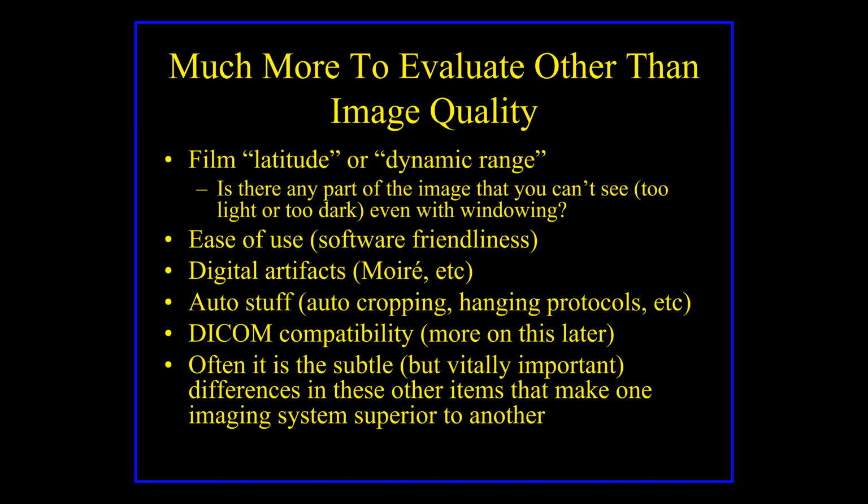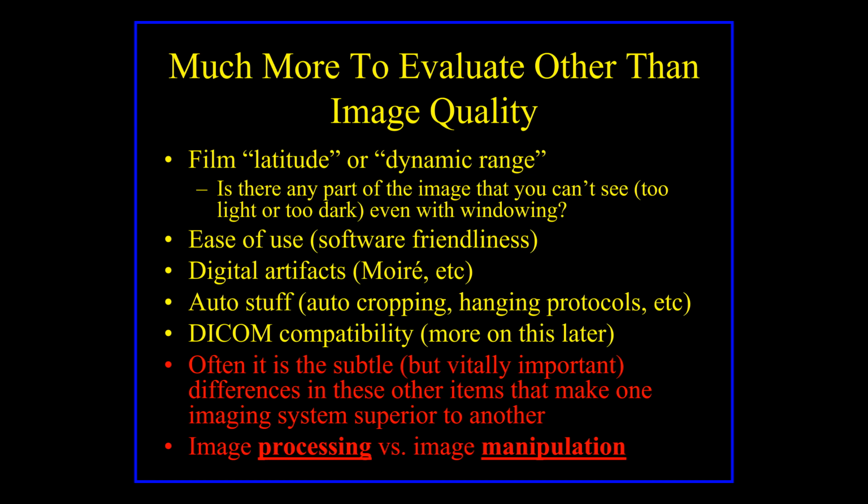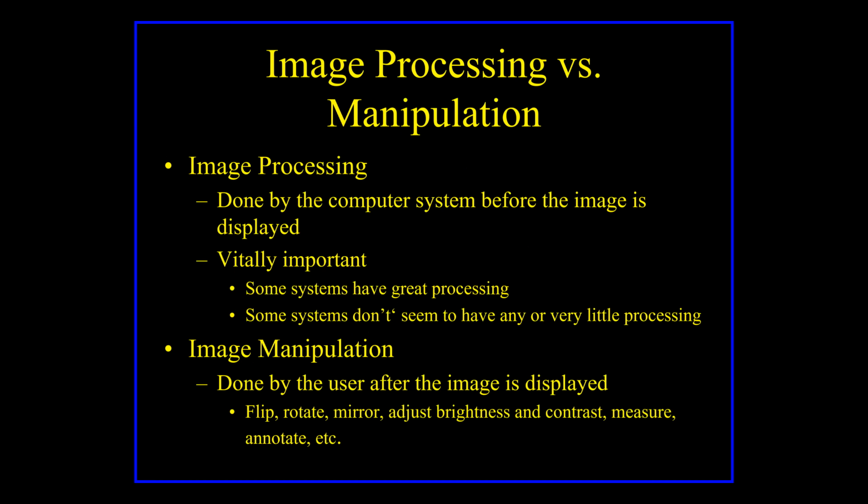So again, some of these differences are very subtle, like the auto stuff and is it fully DICOM compatible? But also some of them are really, really important. So you want to make sure that whatever system you have, everything works together and it will result in a good image that you can store and send around different places.